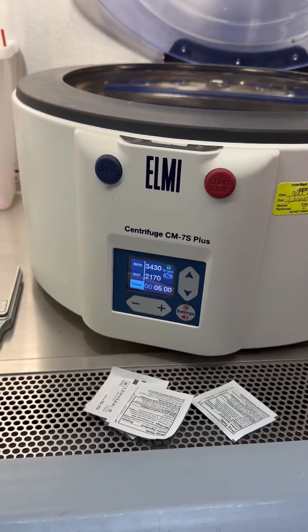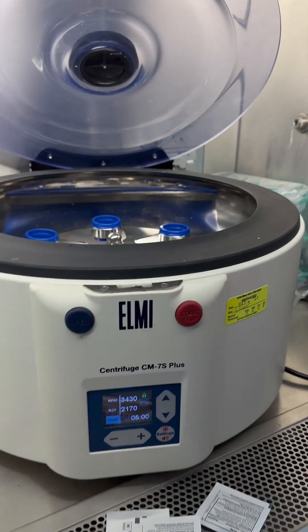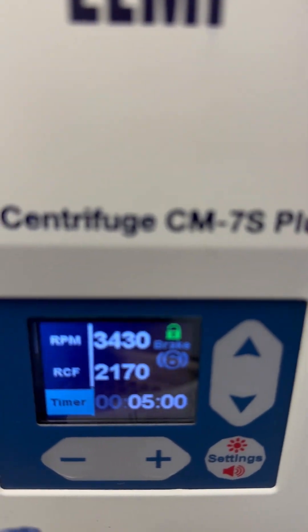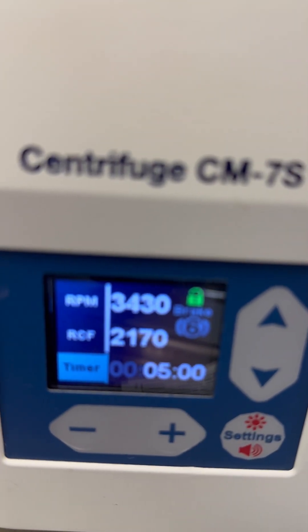Since we've got two machines in this cabinet, unless we're really busy, we just set the second machine up for the second spin. On this one, it's the exact same RPMs and RCF, but notice the brake is six, and the time is five minutes.